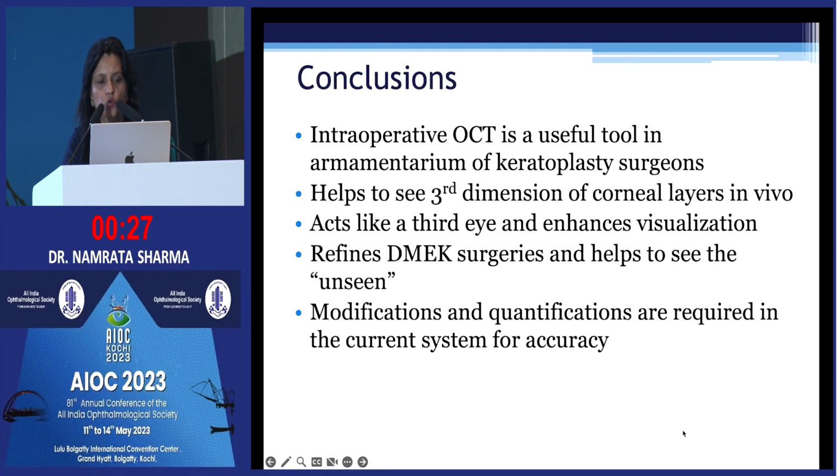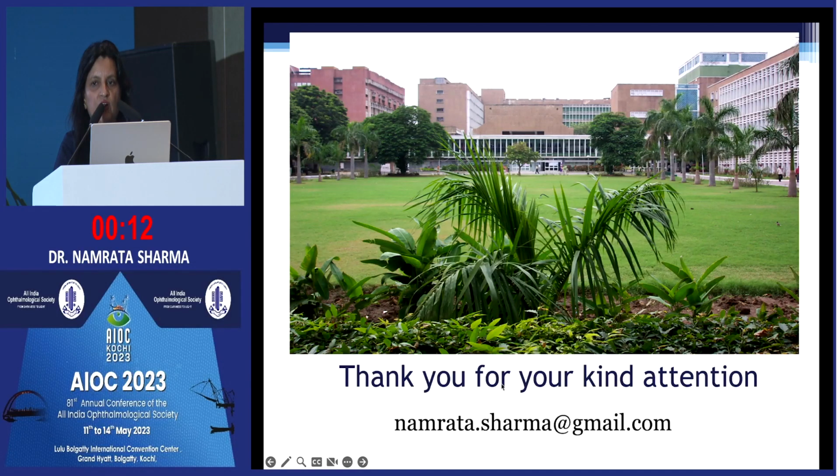So to conclude, intraoperative OCT is a useful tool in the armamentarium of keratoplasty surgeons, and it does help to refine your DMEK surgery and helps to see the unseen. Of course, modifications and quantifications are required in the current system for accuracy. Thank you very much for your kind attention.